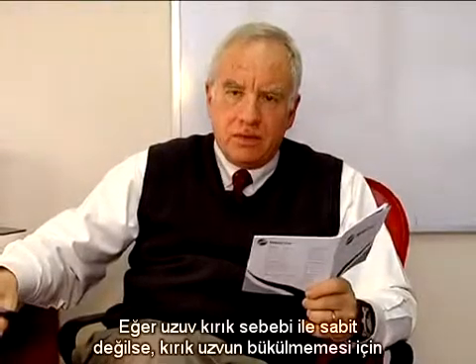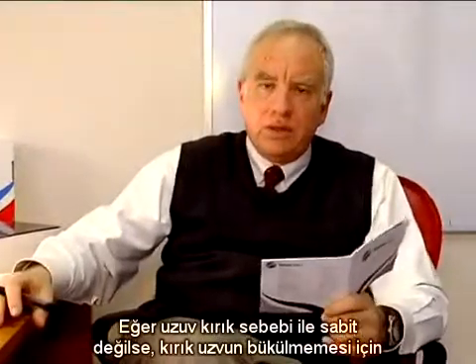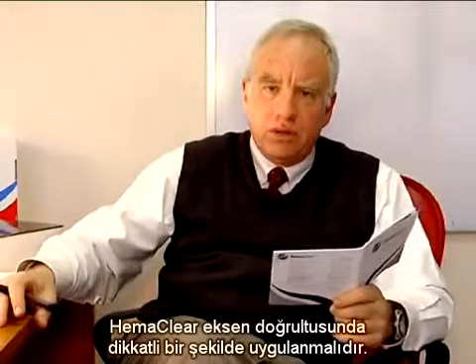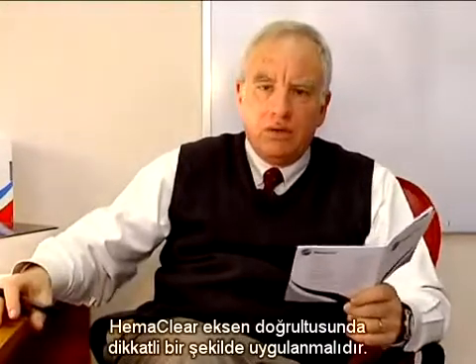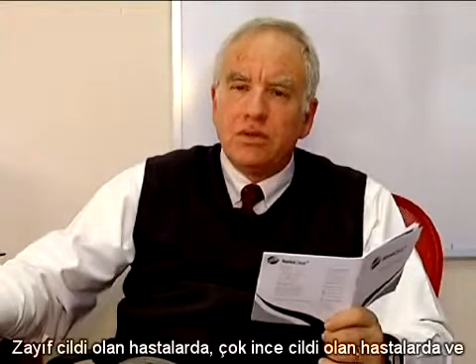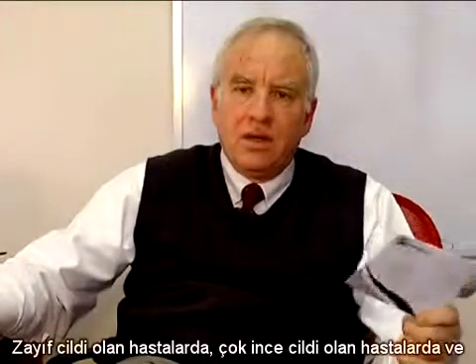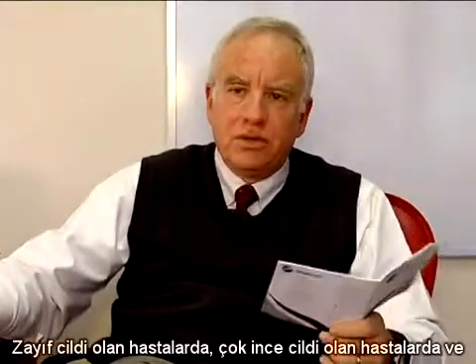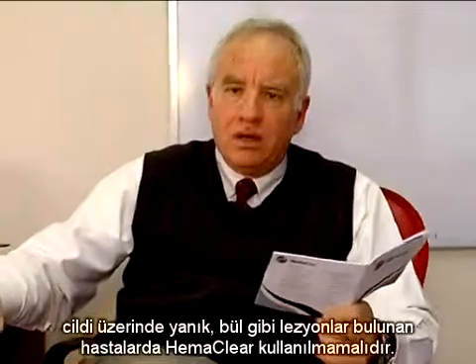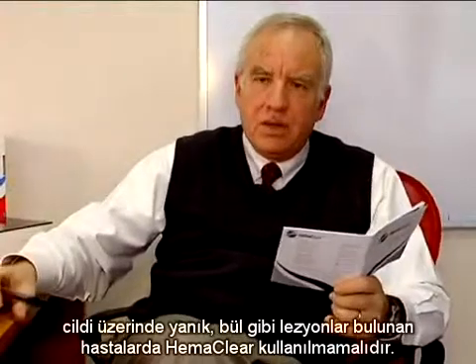If the limb is unstable, namely fractured, the HemaClear should be used with caution and using axial traction to avoid buckling of the fracture. Patients with poor skin that is very thin, like you see in some patients with renal failure, or patients with burns, bulla, etc., HemaClear should not be used.